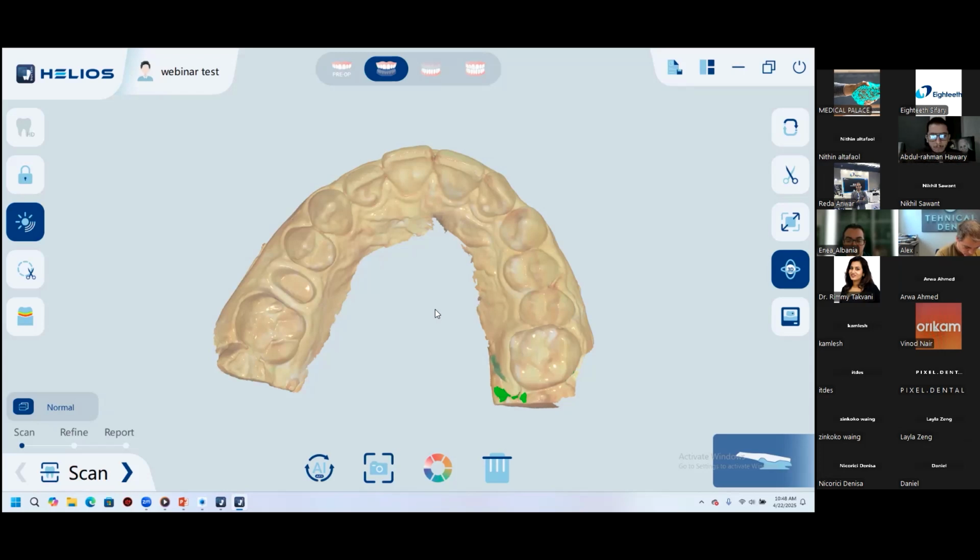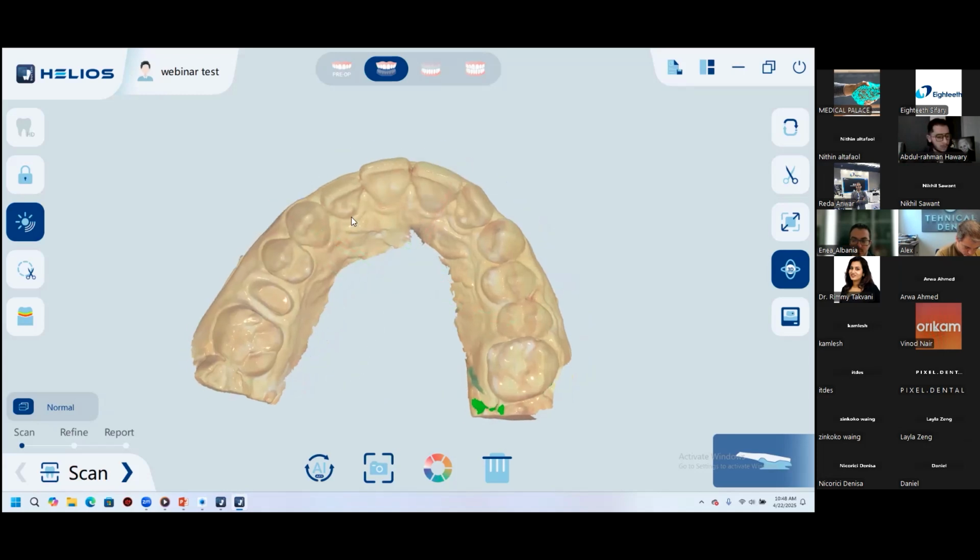What is that number? The number of what? Maximum frames per second our scanner can capture. Of the Helios 500 or the Helios 680? 500. Let me just confirm the frames per second, to tell you the accurate number as much as possible.